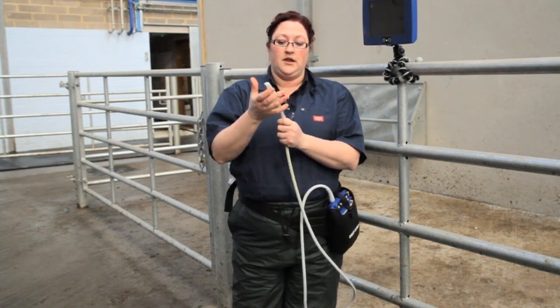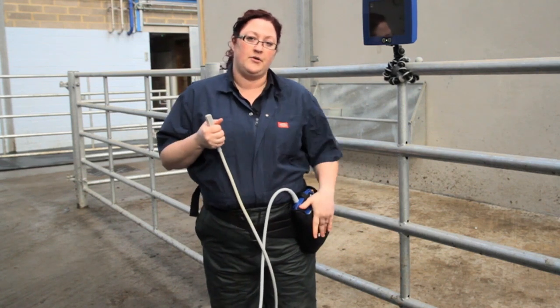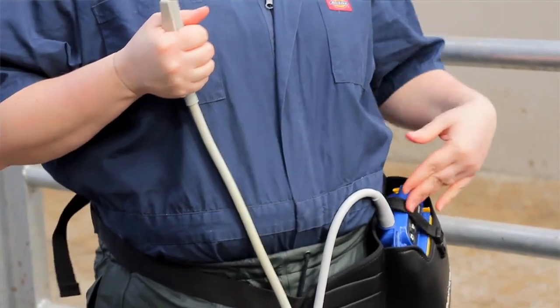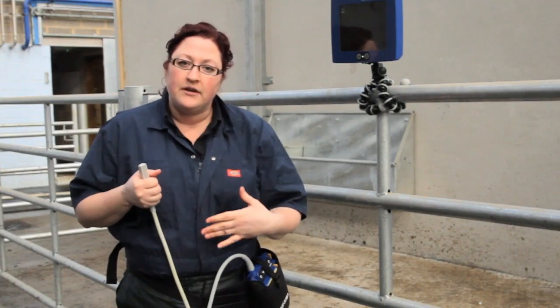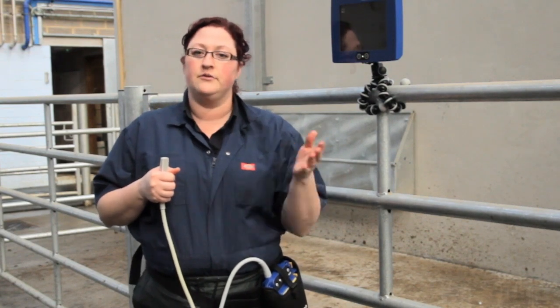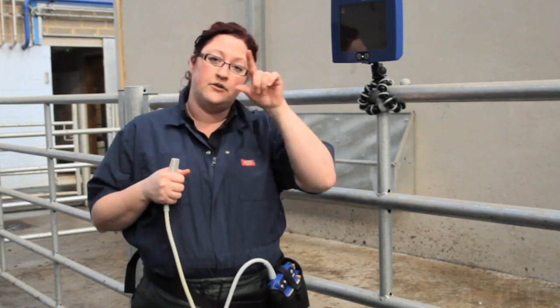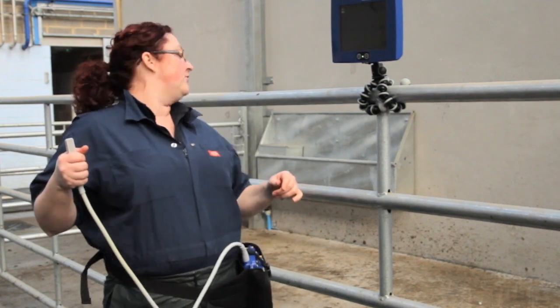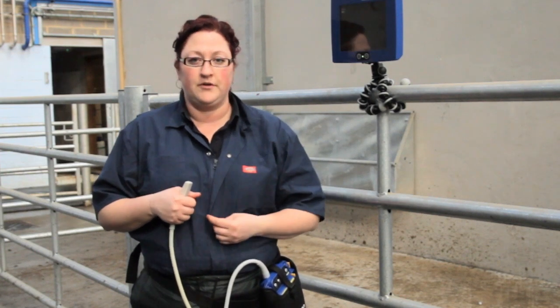I will be scanning right-handed, so I will wear this actually on the left side of my body so that I can control the buttons. If you're using a stationary machine, just make sure that it's out of the flow of traffic and footfall of the cows to ensure it doesn't get knocked over and damaged. But you also need to be able to see the screen without having to crane your neck too much, especially if you're doing a large volume of cows.